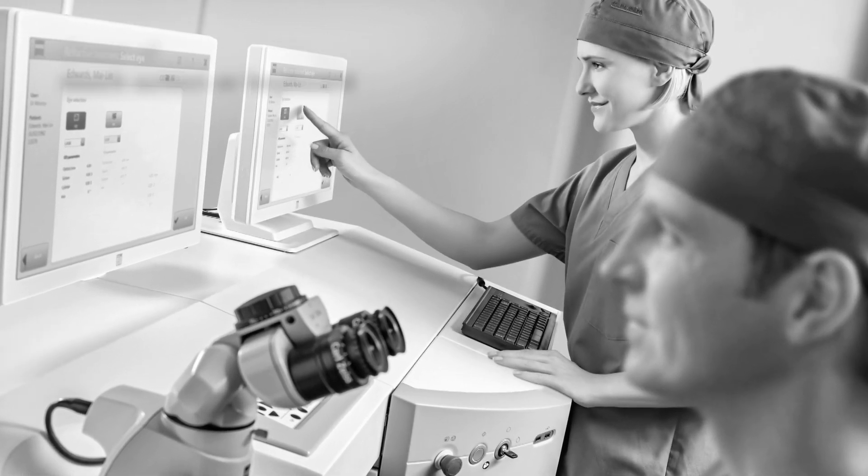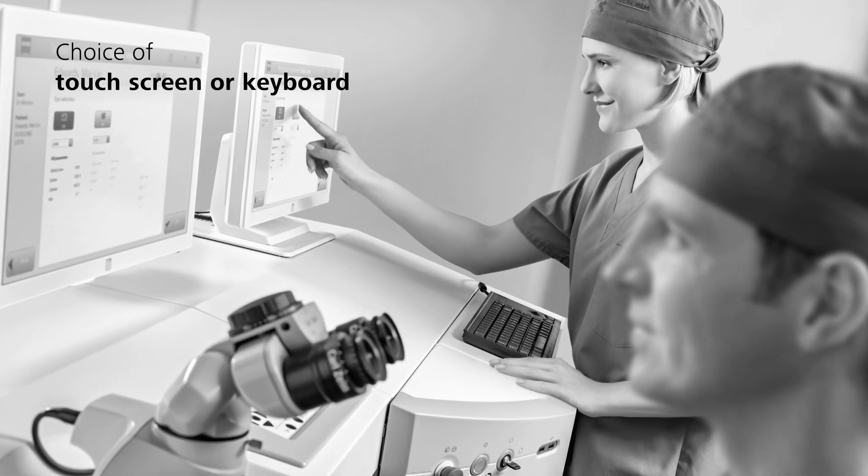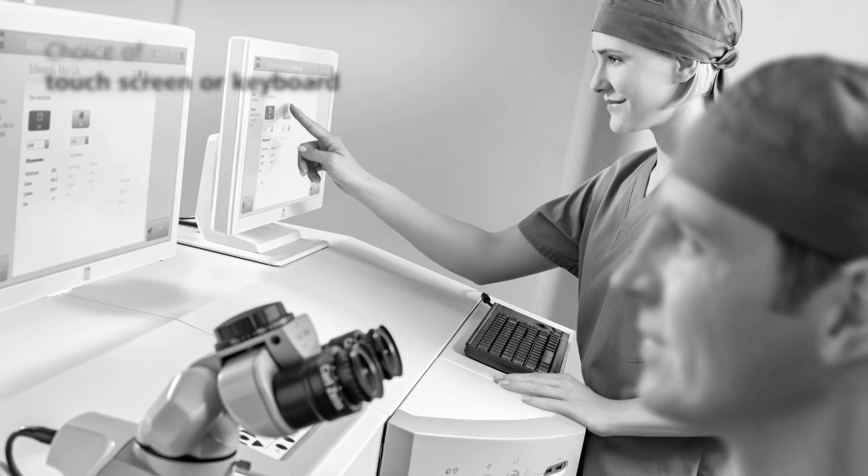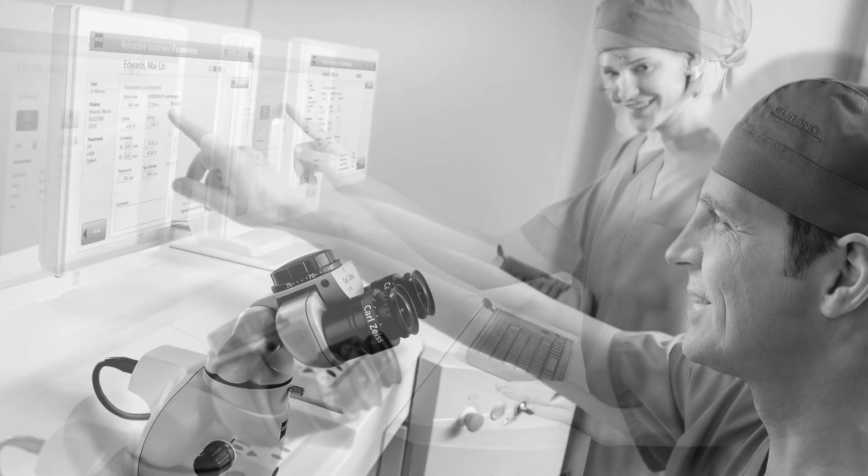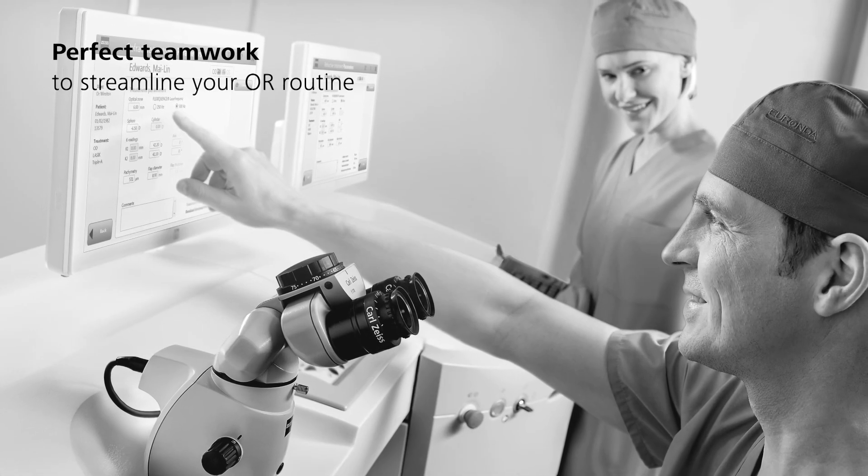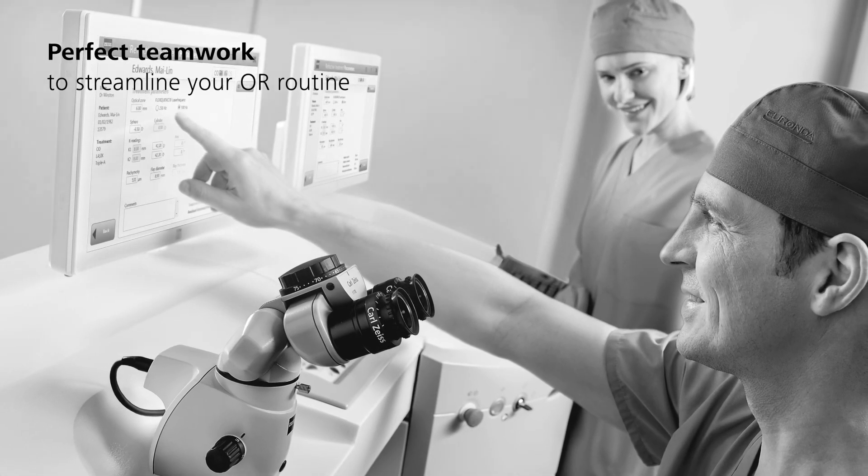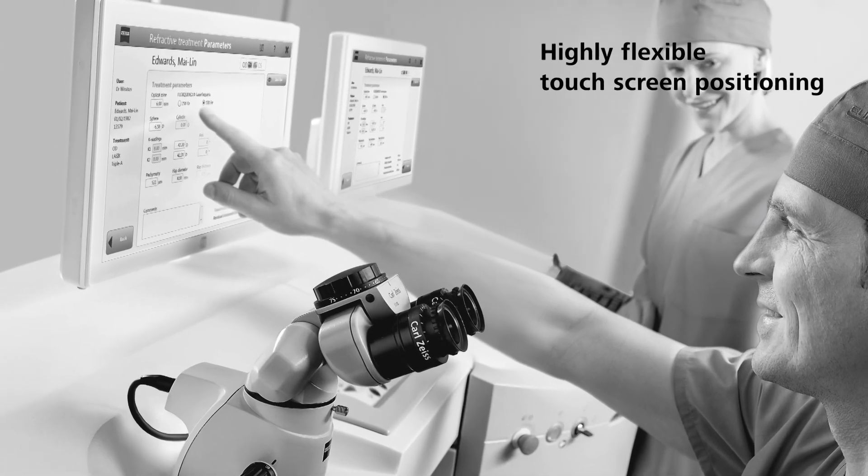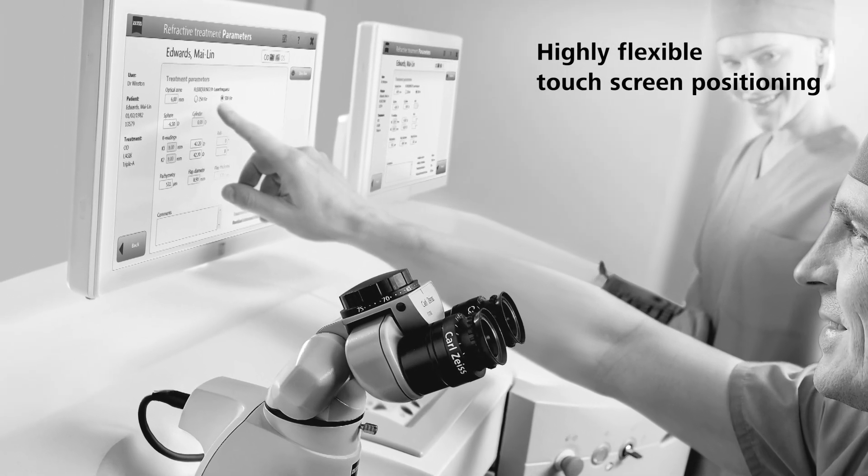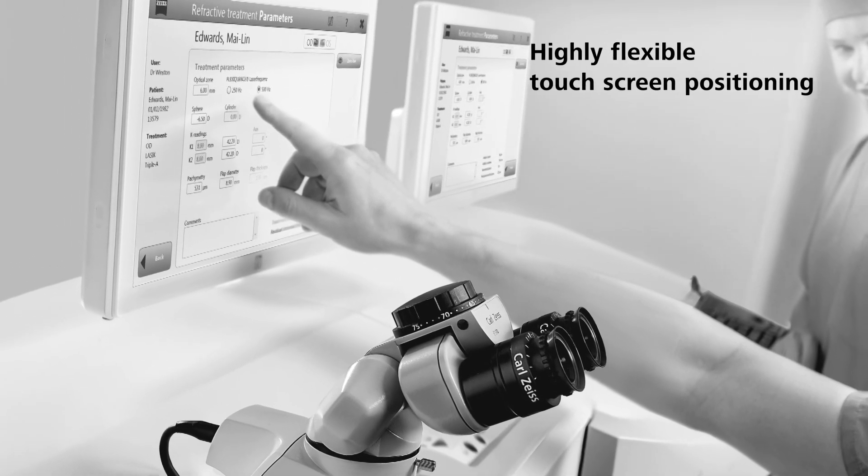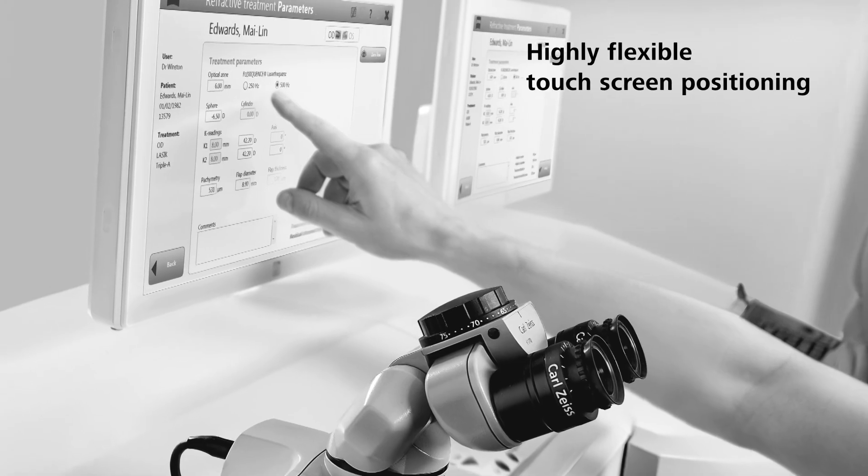Make entries via touchscreen or keyboard at a second workstation. Perfect teamwork to streamline your OR routine. Position the touchscreen where you need it and further optimize your OR workflow.